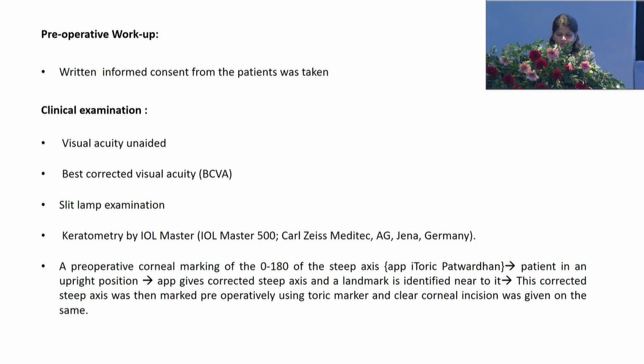Best corrected visual acuity and slit lamp examination were done. The keratometry was done on IOL Master. A pre-operative corneal marking of the 0 to 180 degree of the steep axis was done on the iToric Patwardhan app while the patient was sitting in an upright position. The app gives the corrected steep axis and a landmark is identified near it. The corrected steep axis was then marked while the patient was lying on the table using a toric marker, and a clear corneal incision was given on the same.